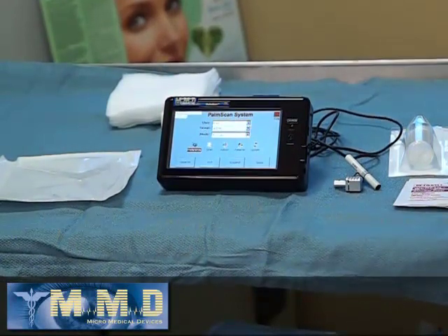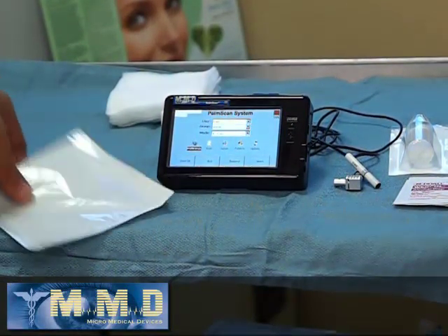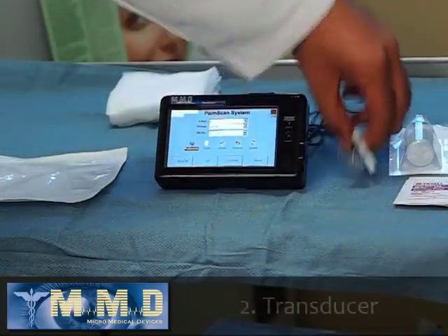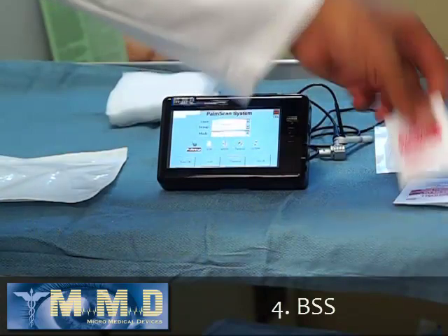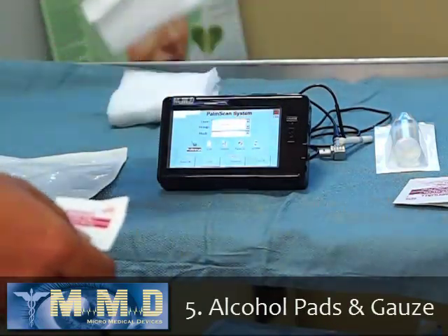The supplies that are needed to do the Easy Immersion are the Easy Immersion Tip, the transducer, and the PalmScan system. I like to use BSS, some alcohol pads, and a few sterile gauze.